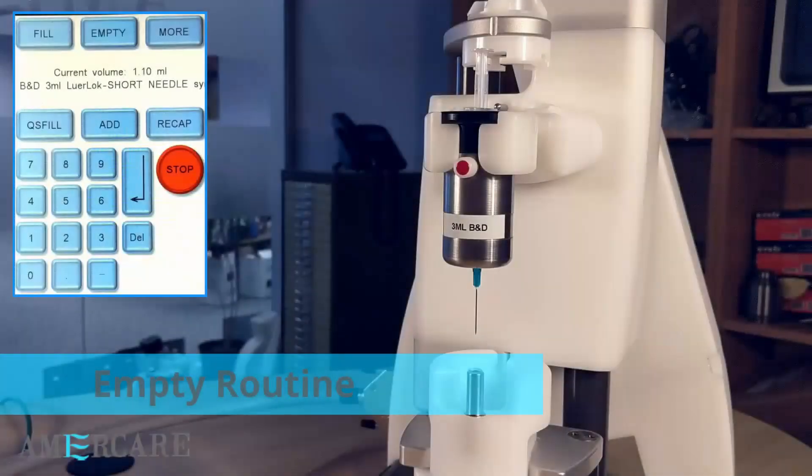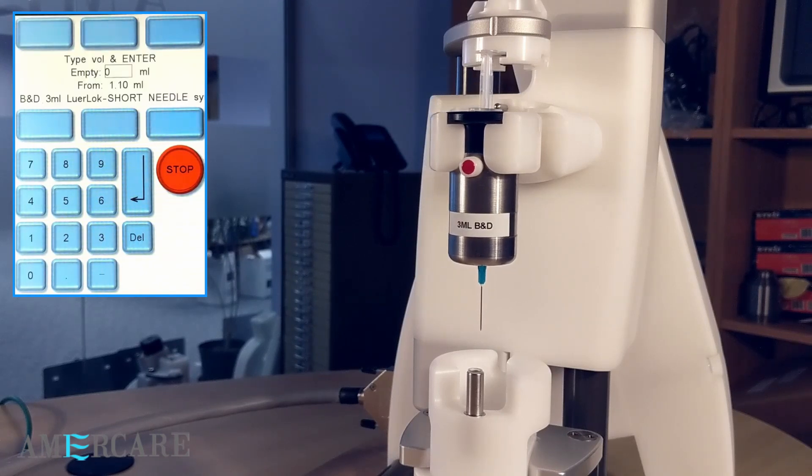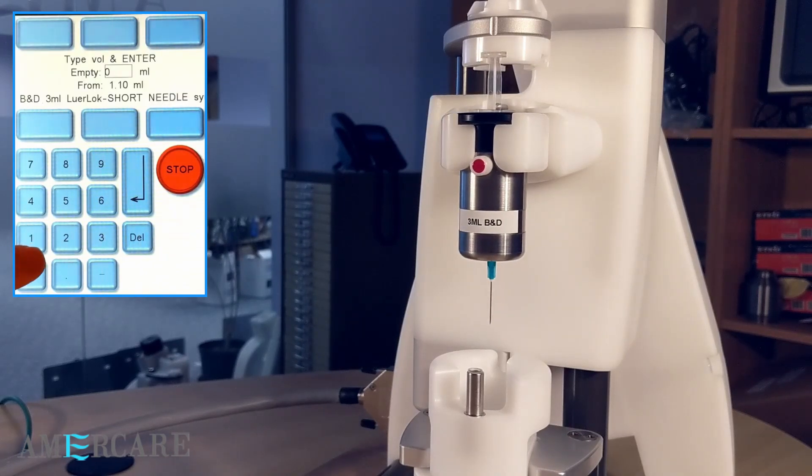With the empty routine, you can partially or fully empty the syringe. Press empty. The syringe will move into the empty position. Type in the amount to empty and press enter.